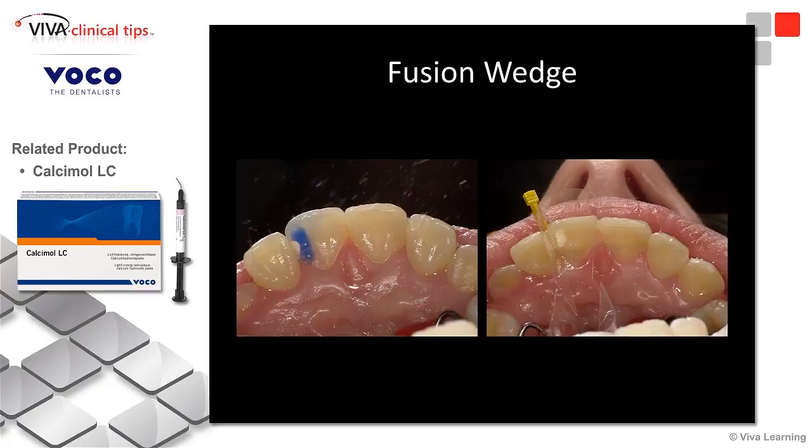I am going to do this in a selective etch technique, so I'm etching the outside of the enamel. This is VocoSid — Voco's 37% phosphoric acid. We've placed our Mylar strip.